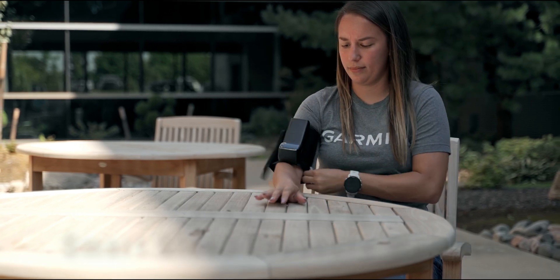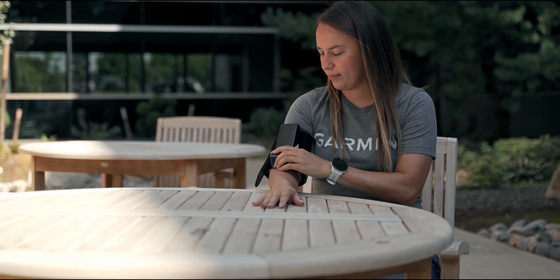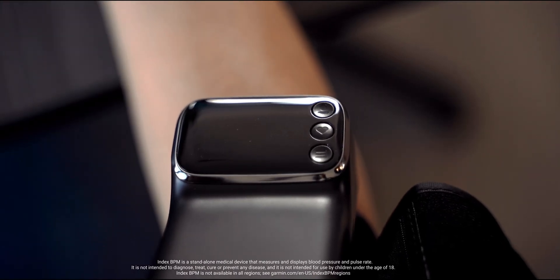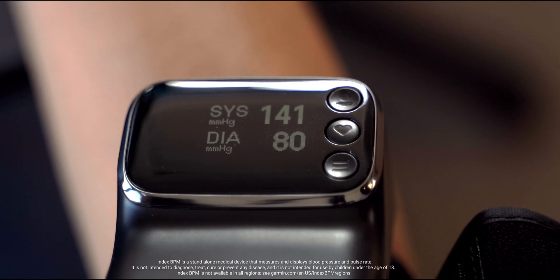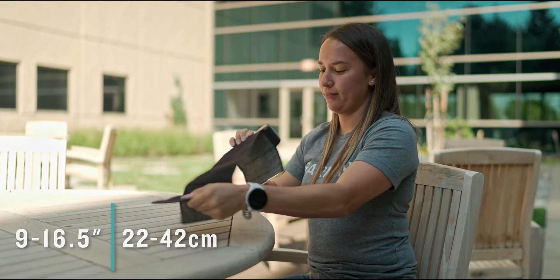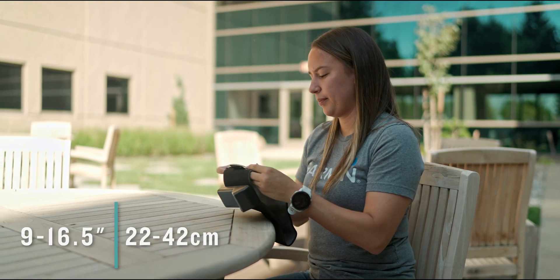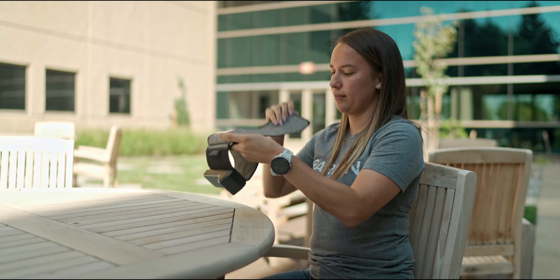This compact, all-in-one device can accompany you virtually anywhere you may need to bring it. After taking your selected measurement, this monitor will present your result on the integrated display. The adjustable cuff was made to fit a wide range of arm sizes, which is beneficial if there's the need to take blood pressure measurements from multiple individuals.